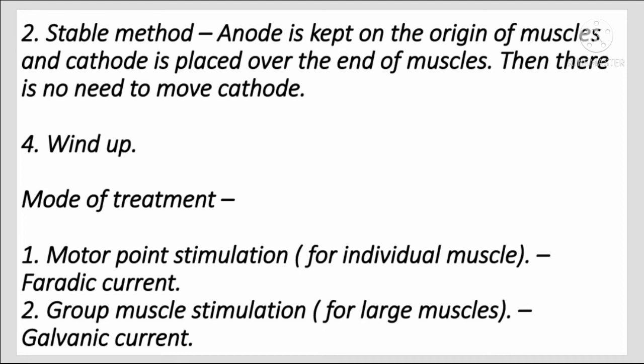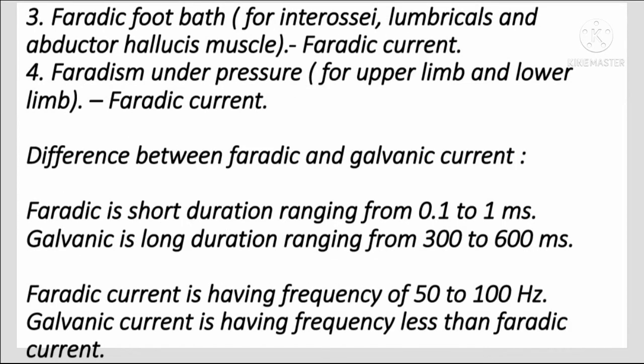Wind up. Mode of treatment. Motor point stimulation for individual muscle, Faradic current. Group muscle stimulation for large muscles, galvanic current. Faradic foot bath for interosseous, lumbricals and abductor hallucis muscle, Faradic current. Faradism under pressure for upper limb and lower limb, Faradic current.